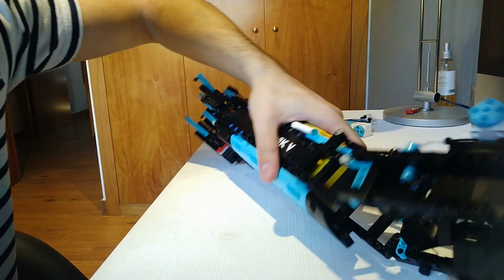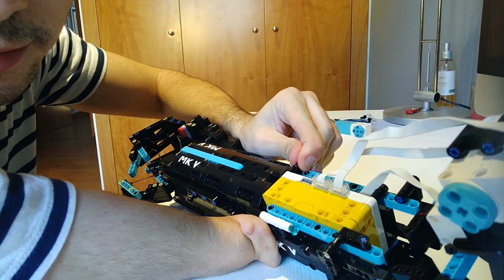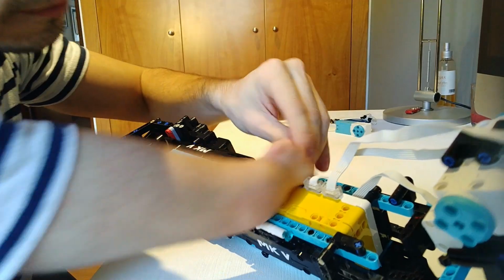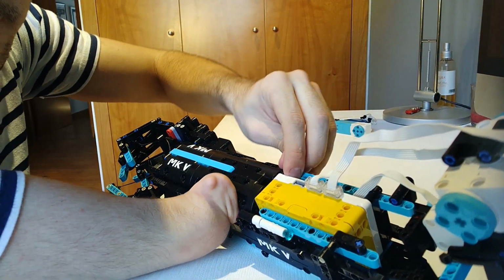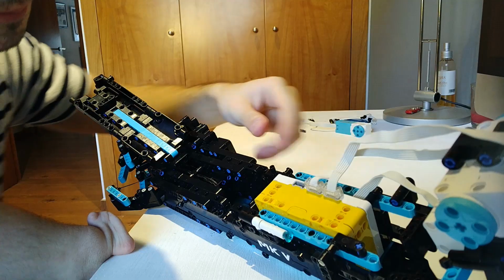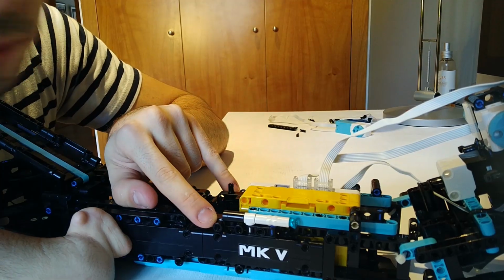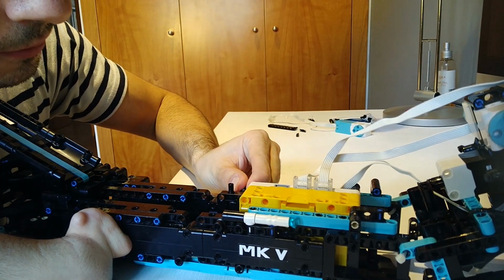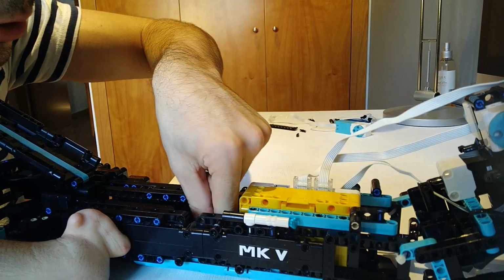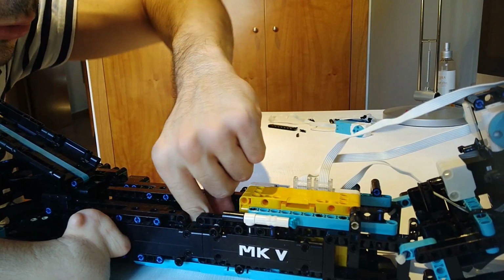Now we need to turn the prosthetic over again. And we need to disconnect this little brick right here from the hub. And you actually need to pull this thing up in order to access the inside of the prosthetic. Right here you can actually see there's one pin on both sides, so you need to remove them. And you'll notice that some things are falling off. That's because we need them to fall off in order to build the motor that is going to move the hand.